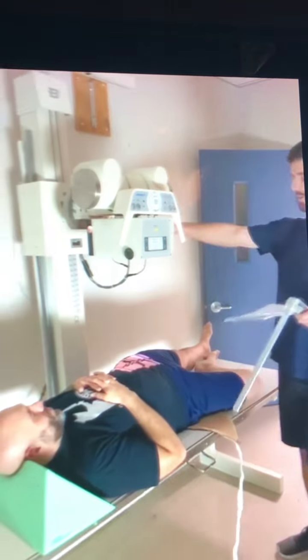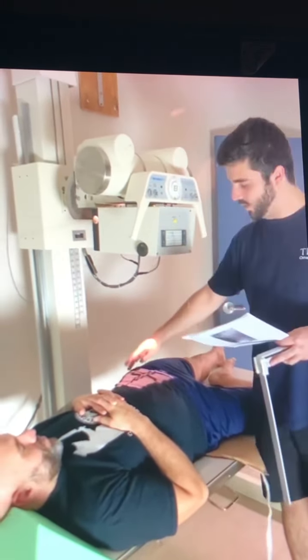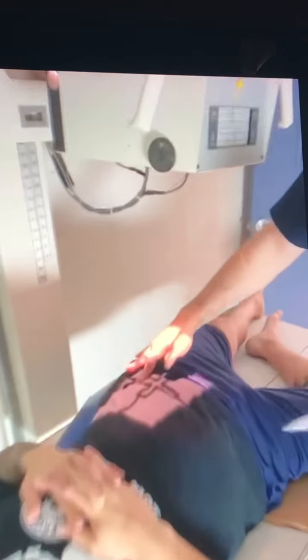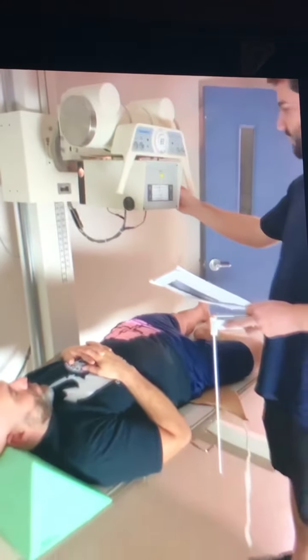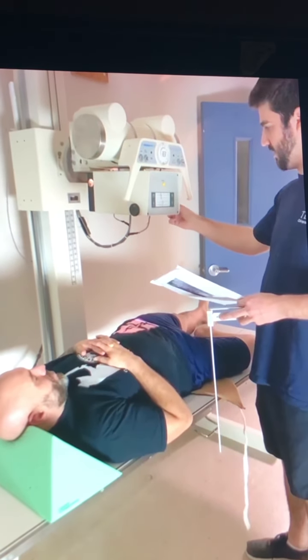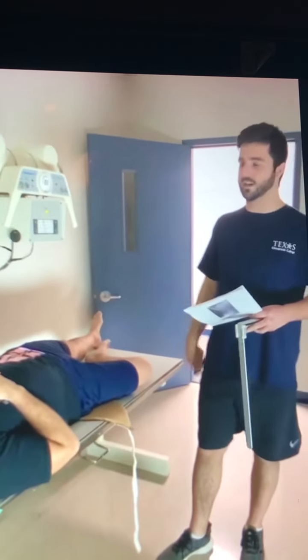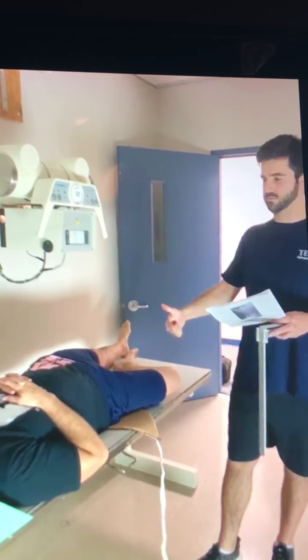40 inches on the Bucky. Where the central ray is, it's 1 inch medial to the inferior margin of the ASIS. So 1 inch medial. And you want to collimate it down to 8 by 10. So the right posterior oblique is actually looking at the left SI joint. Okay, so this is supposed to be the last for that part.